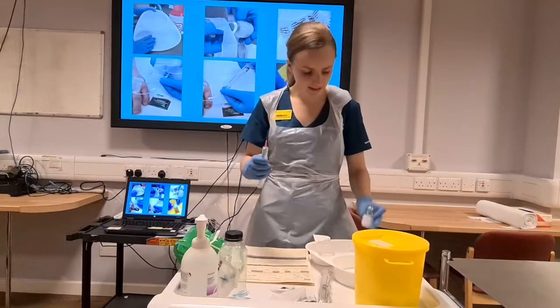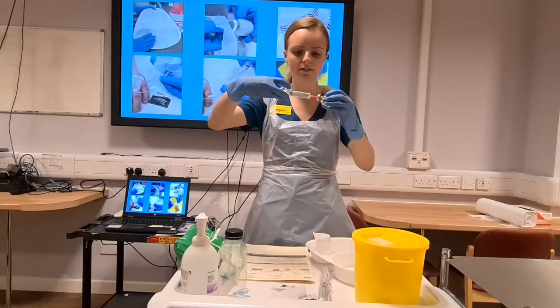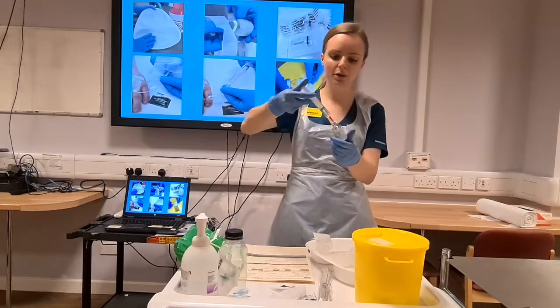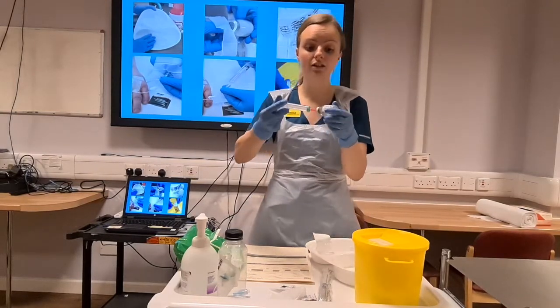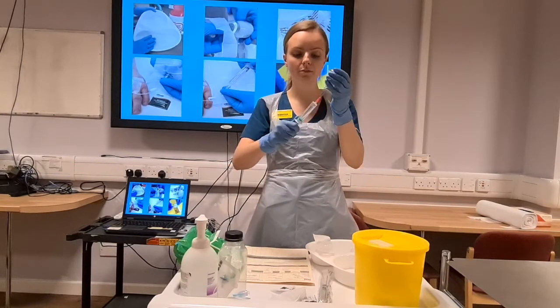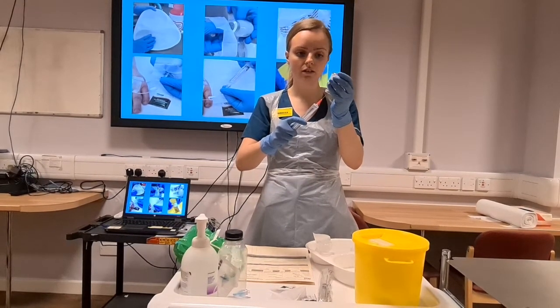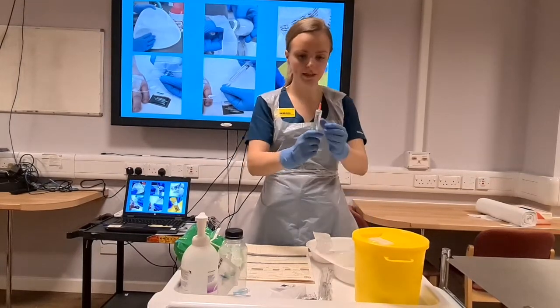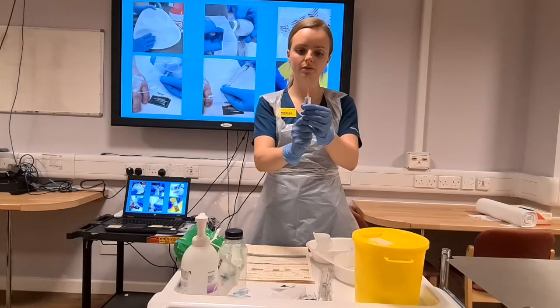Going back to my vial, going directly in. And then injecting my water for injection, mixing it around, making sure it's going to get all of the medication. And then withdrawing, moving the eye of the needle right to the bottom of the vial, like so. Fabulous, that's all that medication. Removing my air bubble once more.